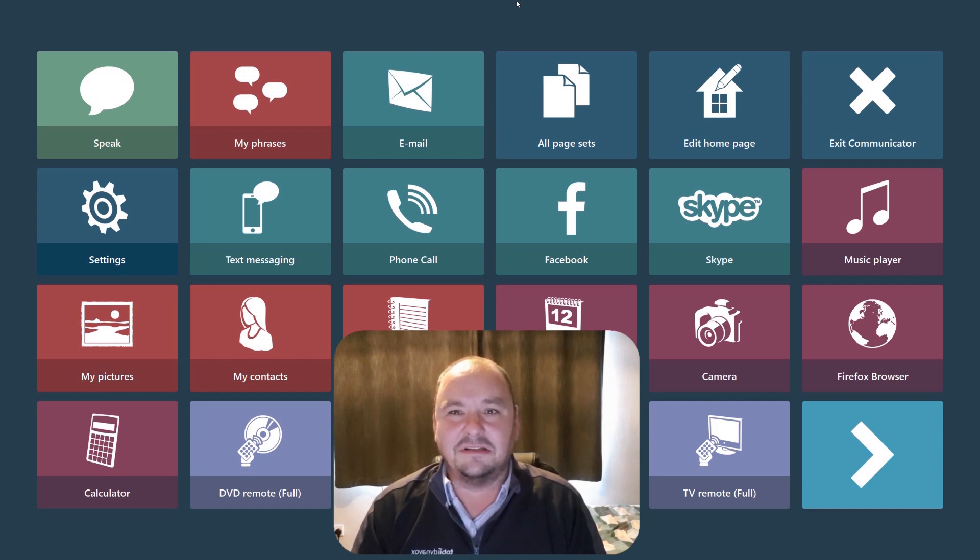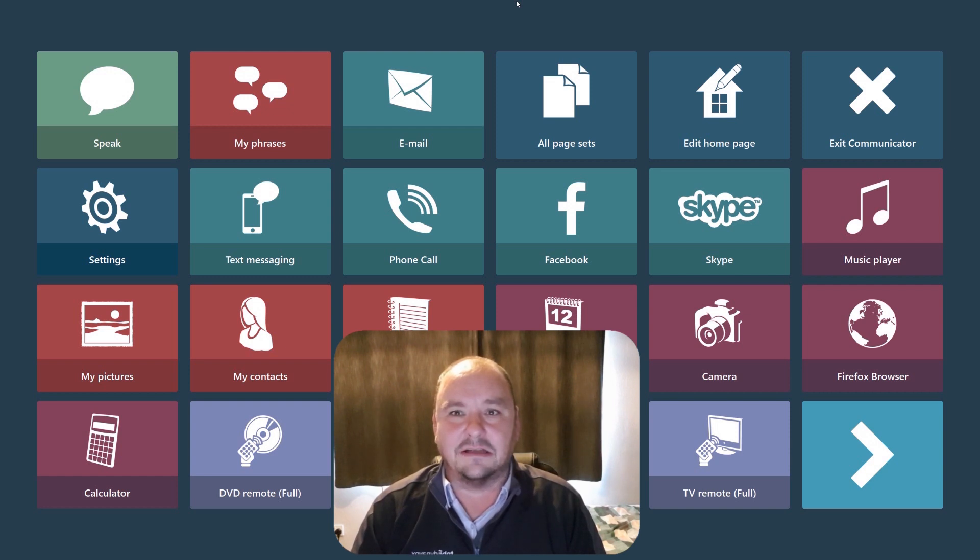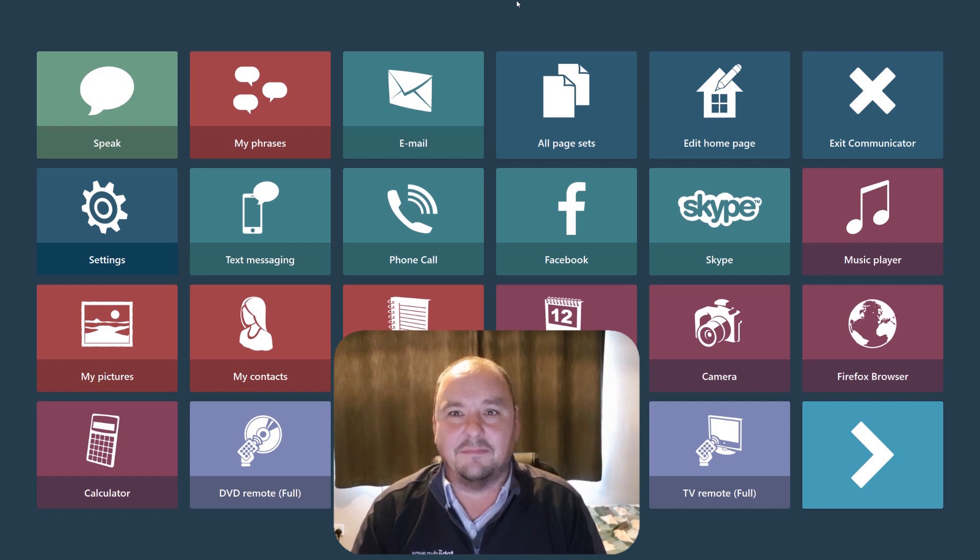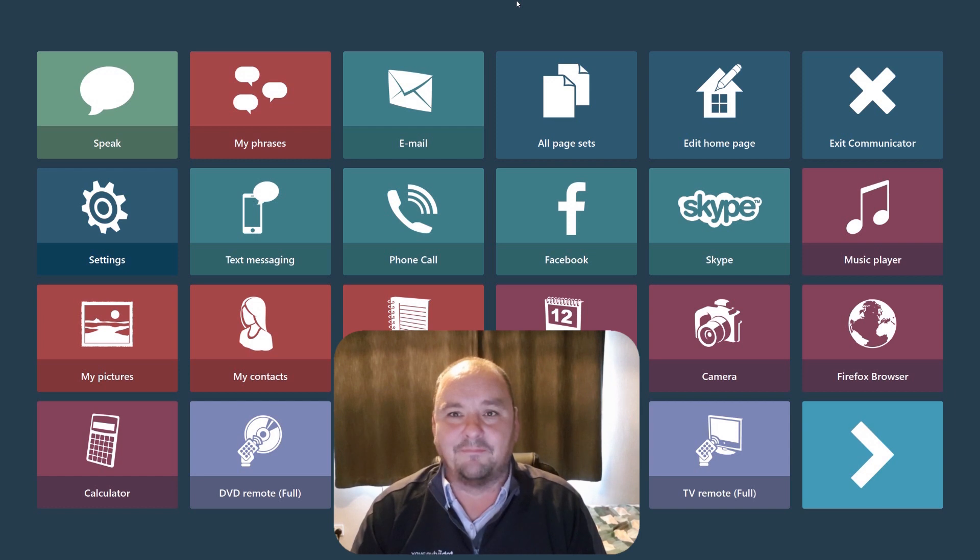Now obviously with the Tobii Eye Tracker you do have access to excellent Windows Control functionality which will allow you to access desktop email tools such as Outlook or web-based email tools such as Gmail.